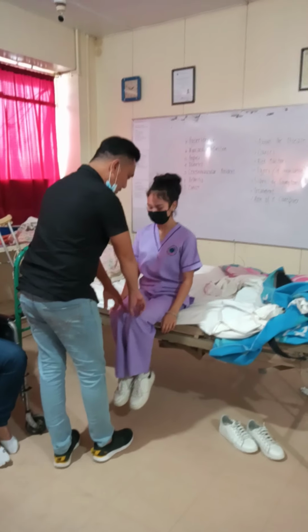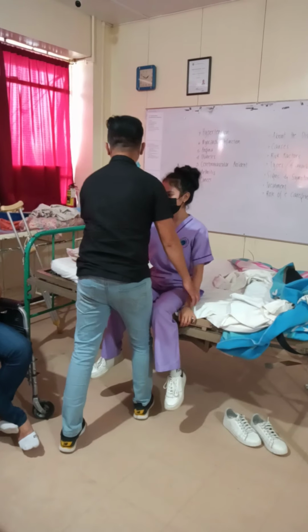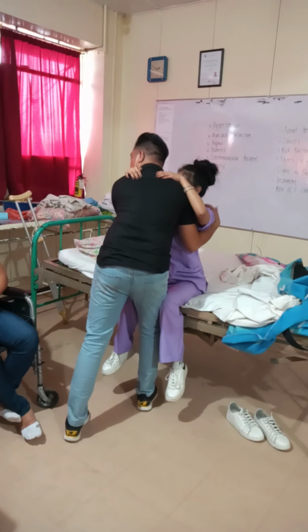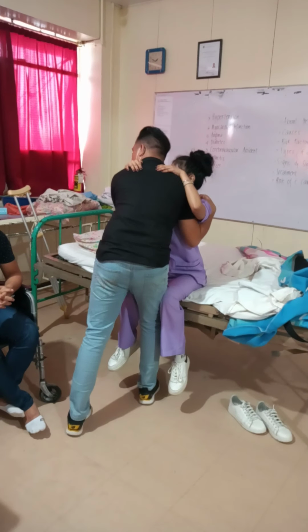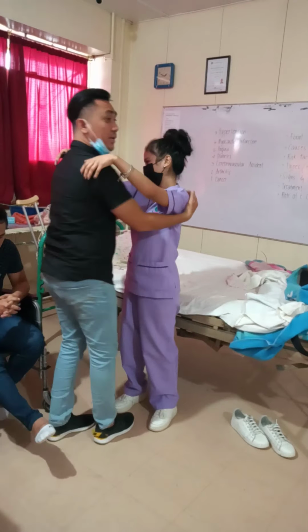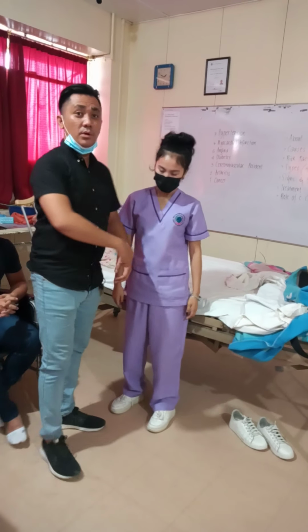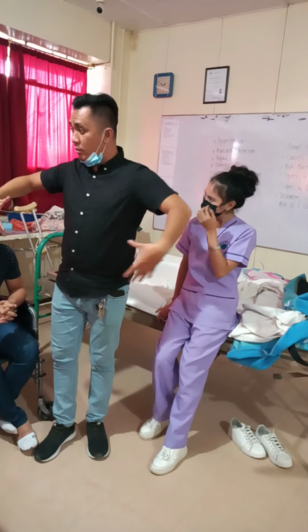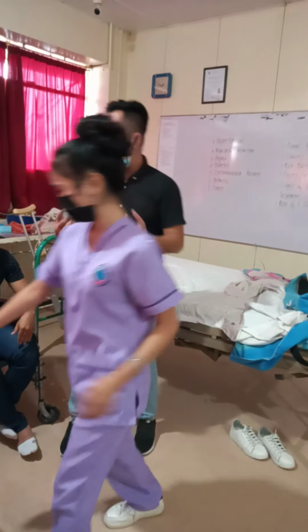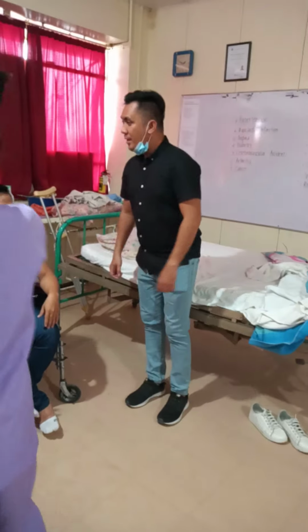So, in between the patient's legs, okay? Then hold the shoulder. Then hold the armpit going to the shoulder of the patient. Then the count of 3, 1, 2, 3, stand. That's simple. If you just hold, it is hard to lift, especially if the patient is big. The tendency is that it is difficult, so be careful.